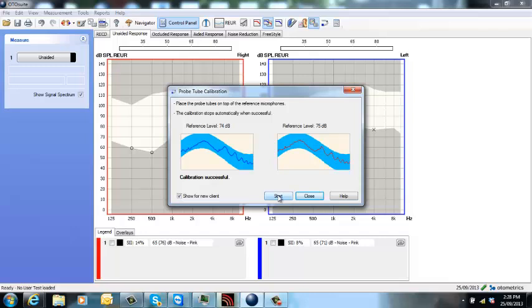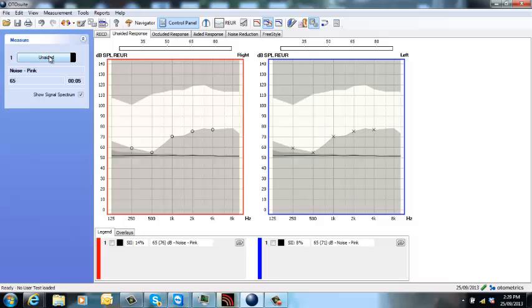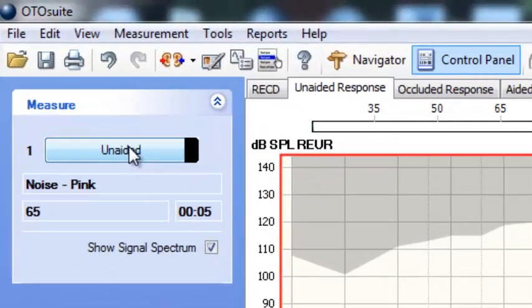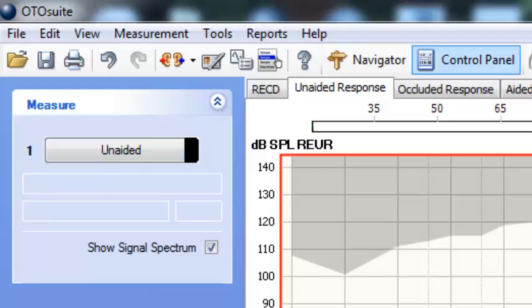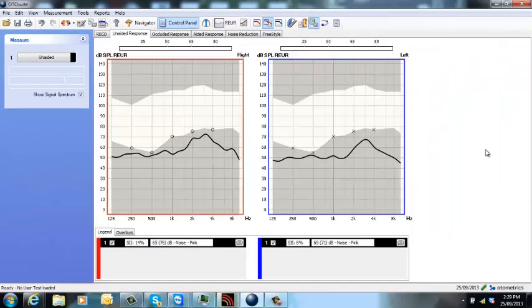When you're happy, just press close and here we are in the unaided response screen. If you hover over the unaided button, it tells you what's going to be presented. So here we can see it's going to be noise pink 65 for five seconds. So if we run an unaided response, here's my result here.